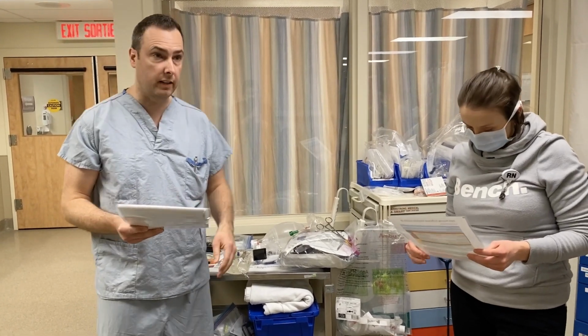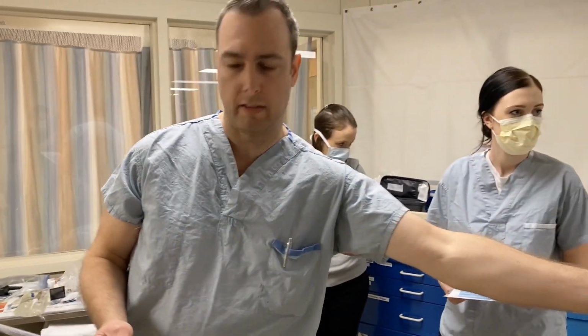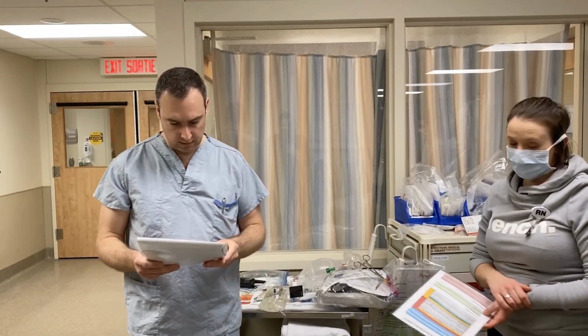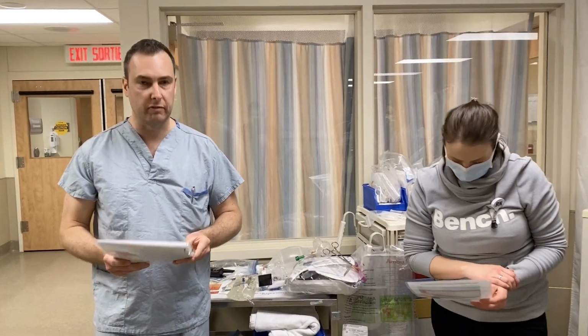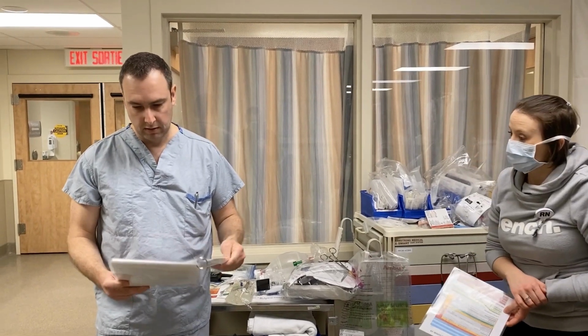We have a walkie-talkie for our outside team. I'll give that to Tina as our secondary RT outside the room. We have an IO gun. Yes, we do. Yep. And we have a triple channel pump if we need to bring it in the room. We do. It's close by. Check. Yep. Excellent. Thank you. So now we've prepared ourselves, our team, and now we're ready to don PPE.